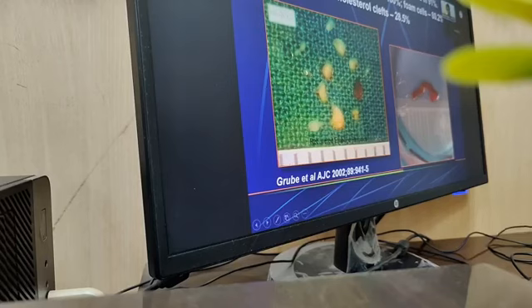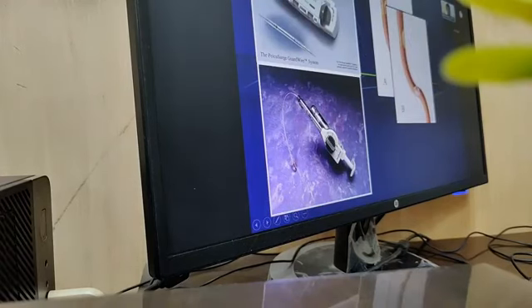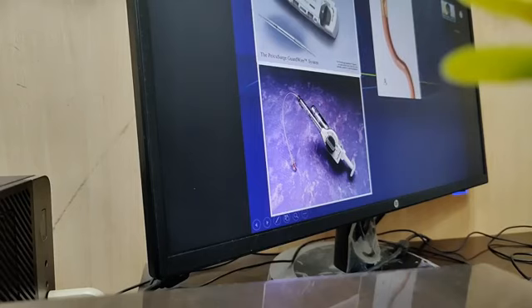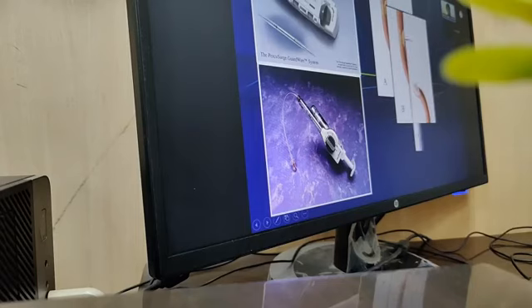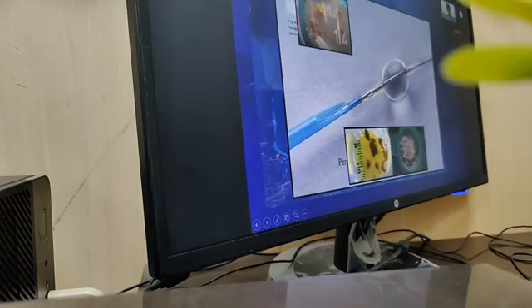PercuSurge aspirates from SVGs, here 103 SVGs. You can see the histopathological pictures of this. This is occlusion and aspiration. This is another view of the material of blockage, atherosclerotic or degenerative material. You put the balloon in place, and then you inflate the balloon and perform the angioplasty, and then the procedure is finished.